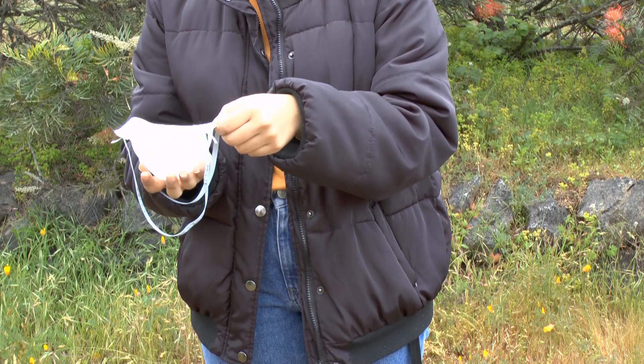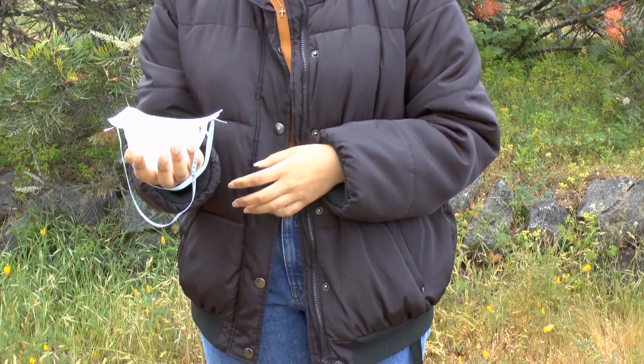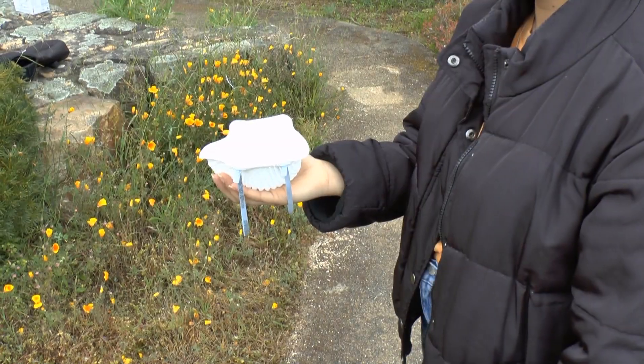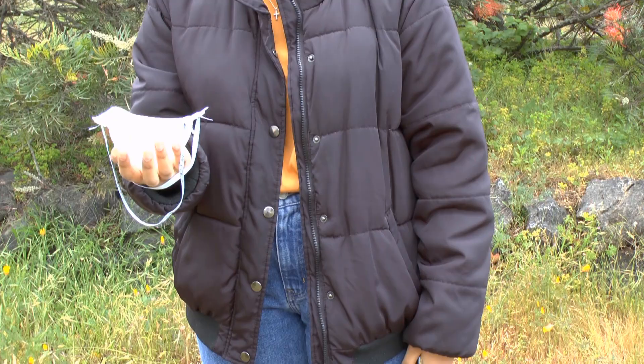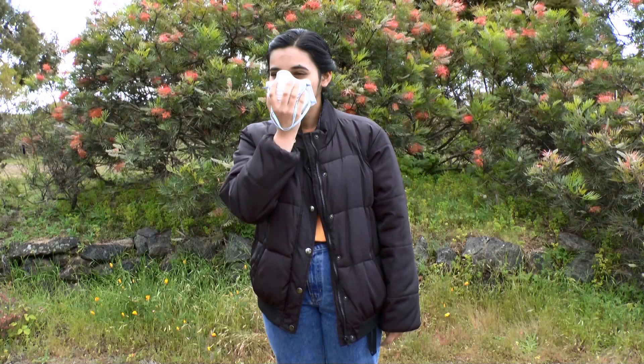Hold the respirator in the palm of your hand with the inside of the respirator facing up and the straps hanging to the side. Respirators with a nose piece should be held with the nose piece towards your fingertips. Place the respirator on your face with the nose piece up over your nose.